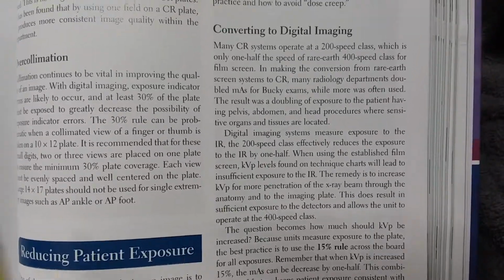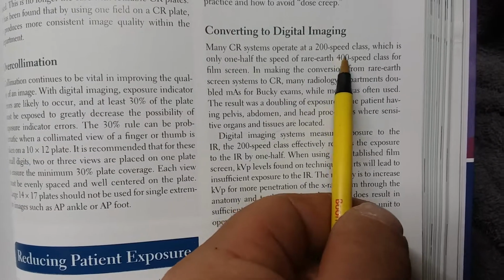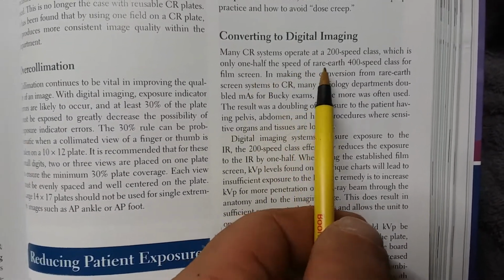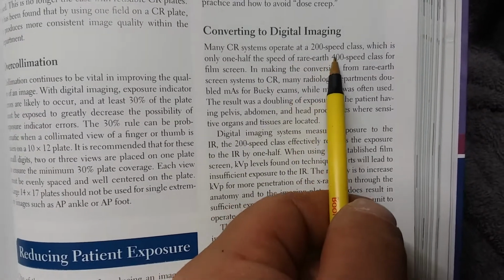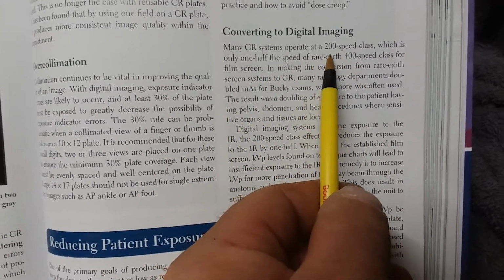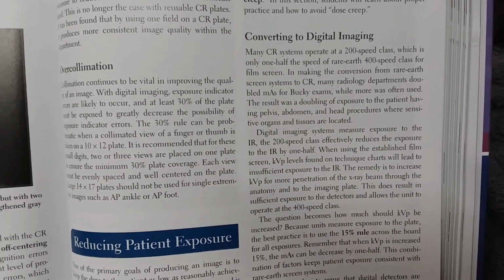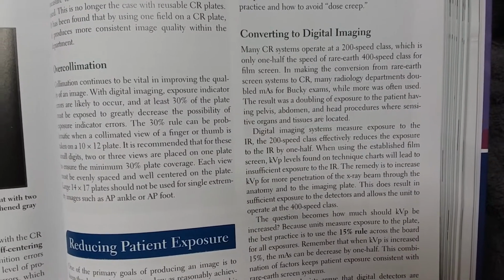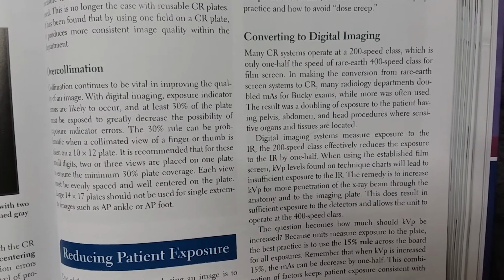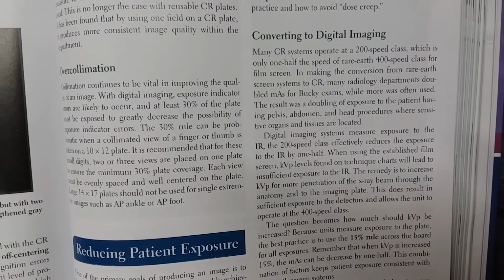All right, on the next page, it talks about converting to digital imaging from film screen, and it says that most CR systems, or many of them, operate at a 200 speed class compared to film screen. It's what it's talking about when it says rare earth speed class was 400 for film. That means digital imaging does not convert the X-ray signal into digital data as quickly as it was converted on film screen into an image. 200 speed is only half the speed of 400.